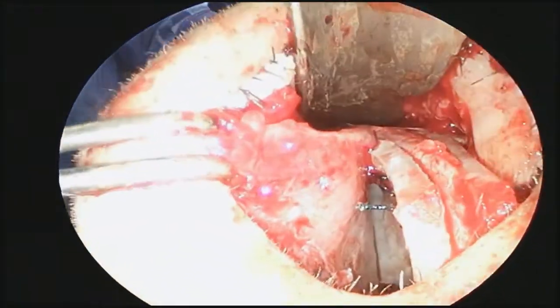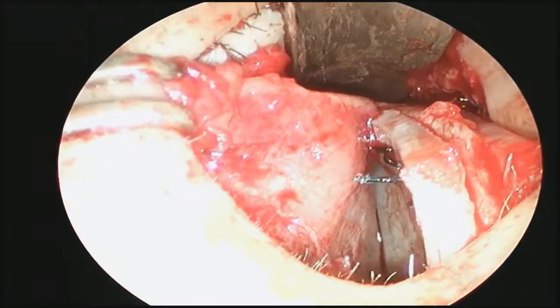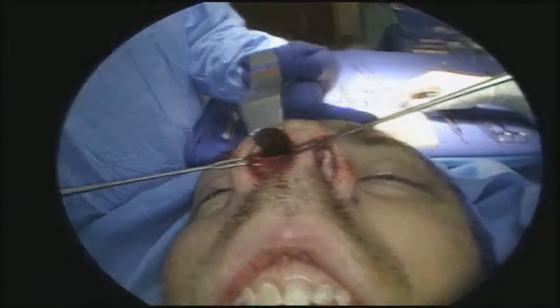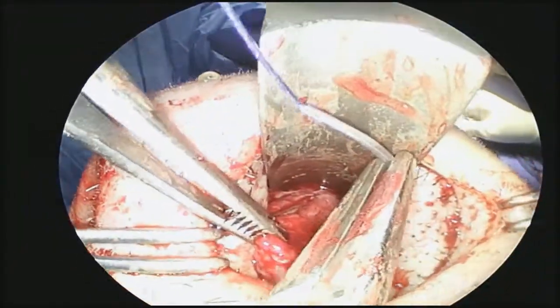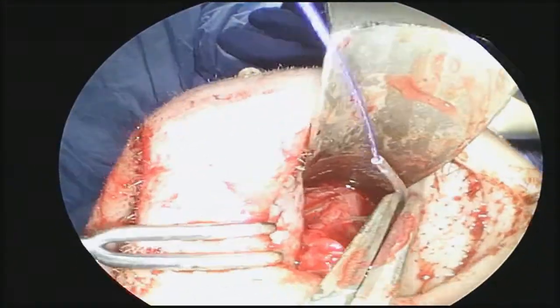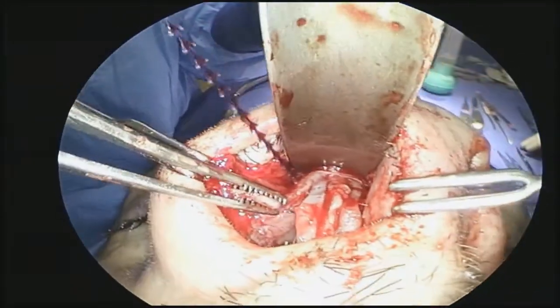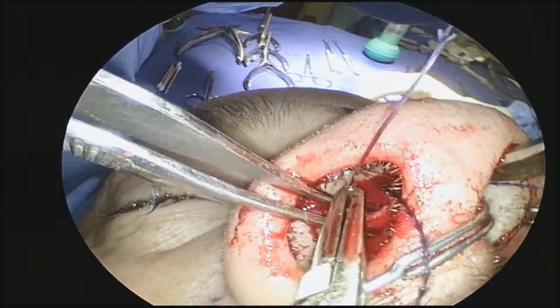There are several different manufacturers of barbed sutures, which come in various materials, diameters, needle types, and barb sizes. A different type of barbed suture is then used to reattach the upper lateral cartilages to the spreader graft septal complex in a running horizontal mattress fashion.